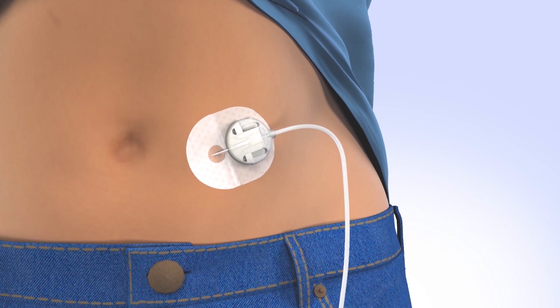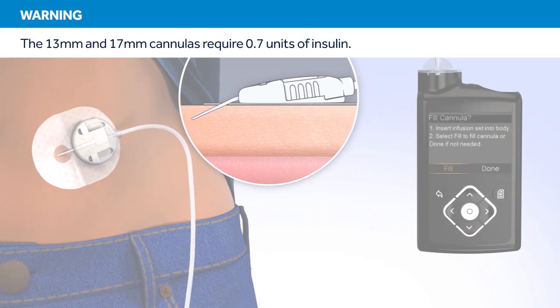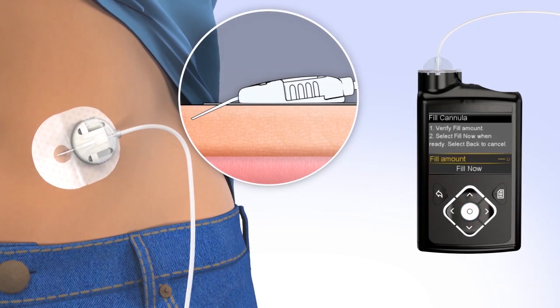Now that the introducer needle is removed, the cannula is empty and will need to be filled with insulin. It takes 0.7 units to fill both the 13 and 17 mm cannula. To fill the cannula, select Fill. The Fill cannula screen will appear with either dashes or the amount you previously used. To change the fill amount, press Select and use the arrows to scroll to the amount needed and press Select again. If the amount is correct, press down to Fill now and press Select. The pump will begin to fill the cannula and display the amount. Congratulations! You have successfully filled your reservoir and changed your site.